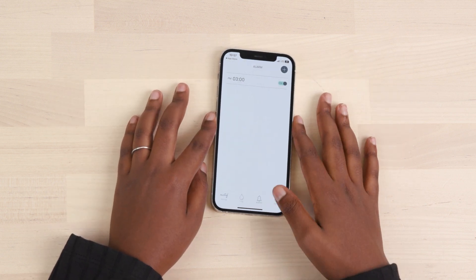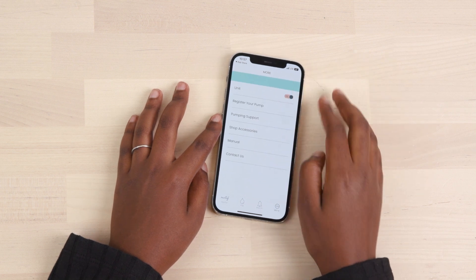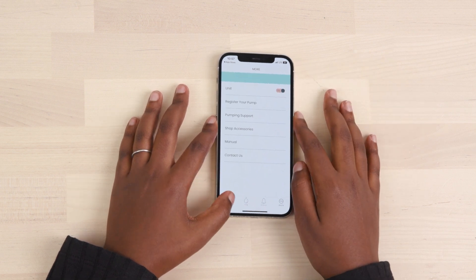From the Settings tab, you can change the unit of measurements, find frequently asked questions about the Motif Aura, and check for any available app updates.